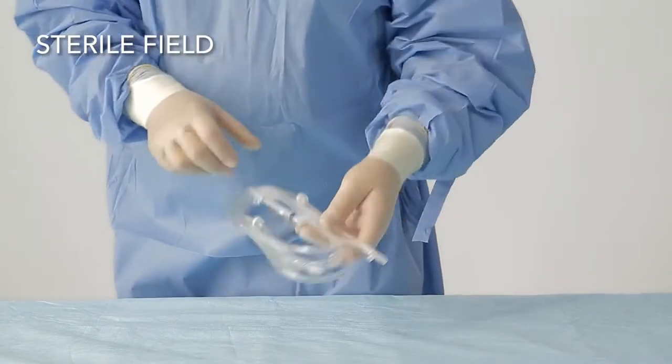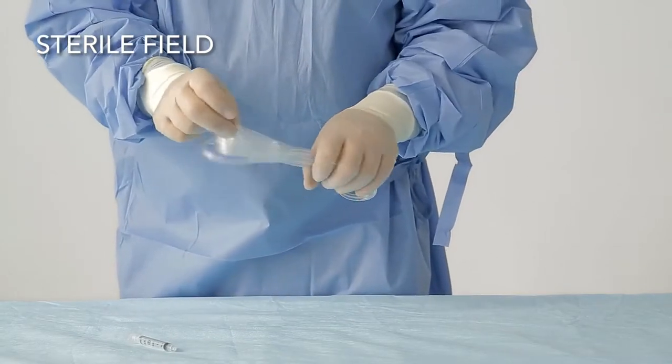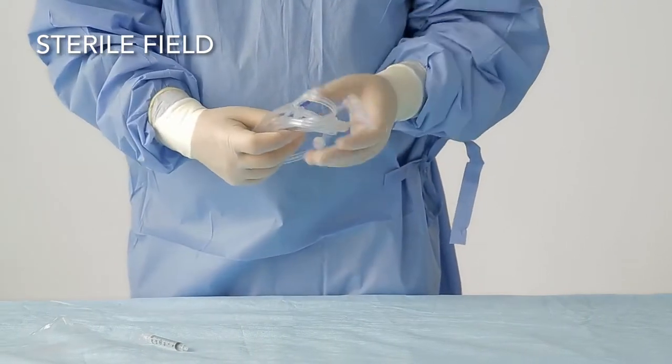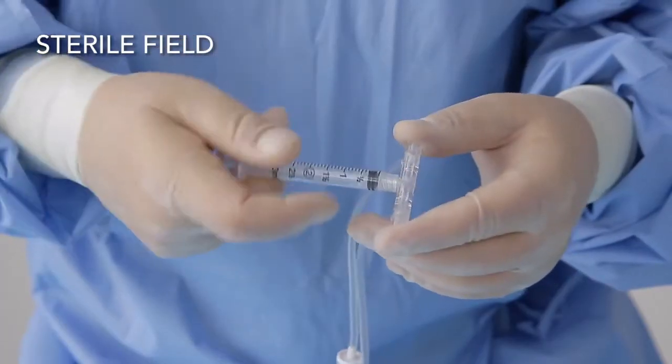Now a sterile assistant or urologist can assemble the unit. Remove plastic band, identify the manifold and attach syringe tightly to the manifold.